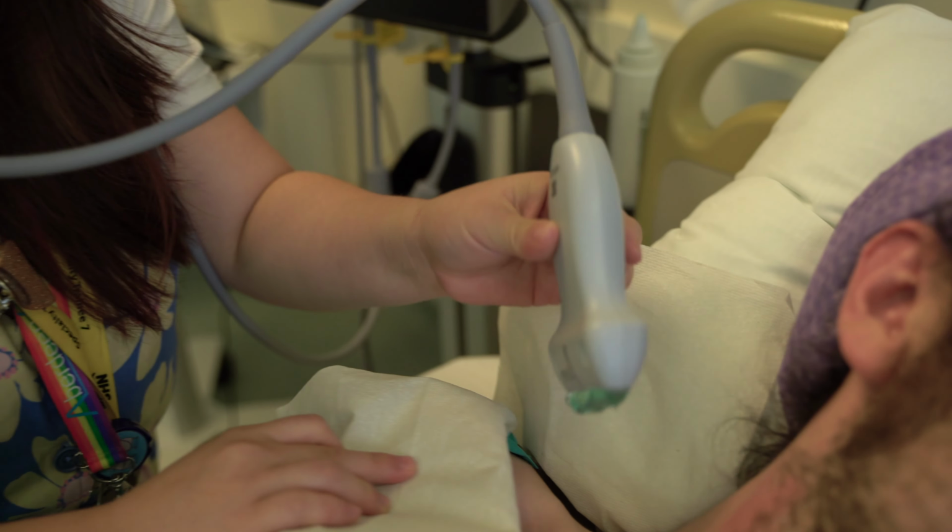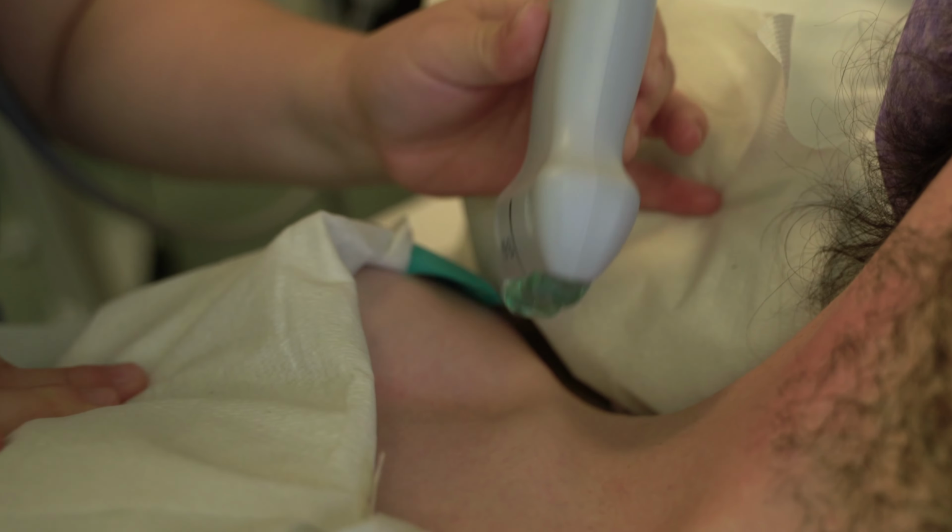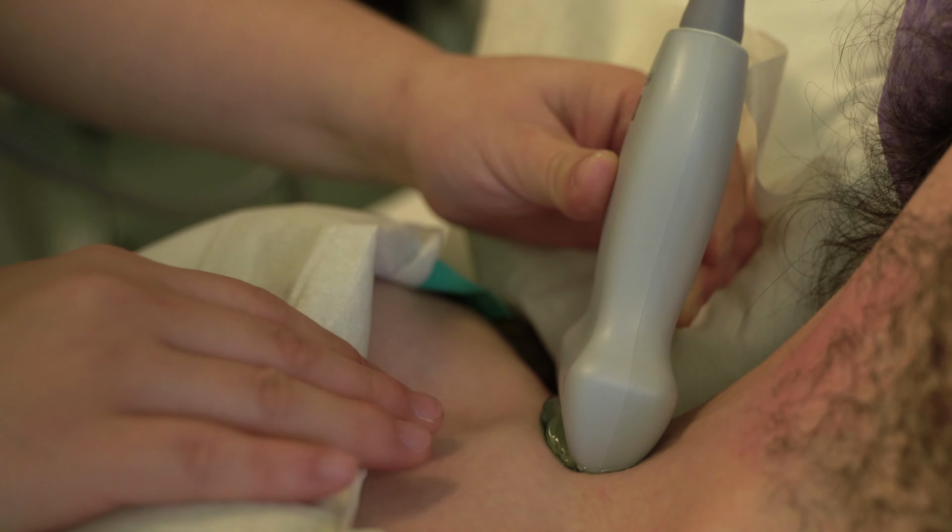Now on to ultrasound technique. We can split this into two parts. The first is transducer handling and the second is needling approach. Let's tackle transducer handling first. Now this may seem like teaching your grandma to suck eggs, but the first step is to consider your hand dominance. You want to hold the transducer with your non-dominant hand, leaving your dominant hand available for the actual procedure. For example, I'm right-handed, so I would hold the probe in my left hand, and for the right hand, I would use that available for the needling or for anything else that I'd like to do with fine movements. I would recommend holding the probe like a pencil.